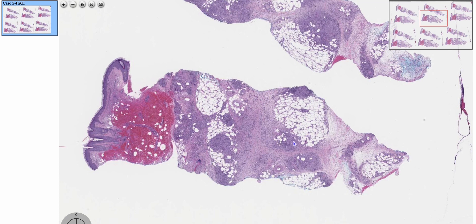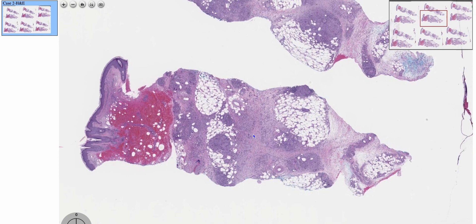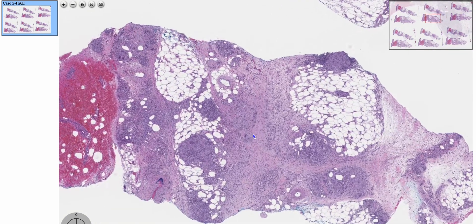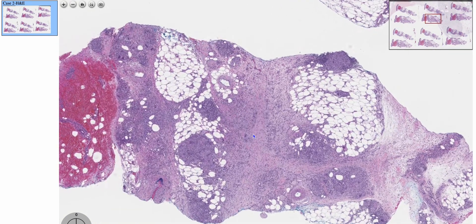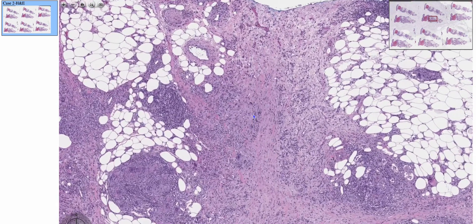In real life, you generally get a spectrum of both septal and lobular paniculitis. So if it's hard sometimes to tell the difference, that's okay, because it's often mixed.